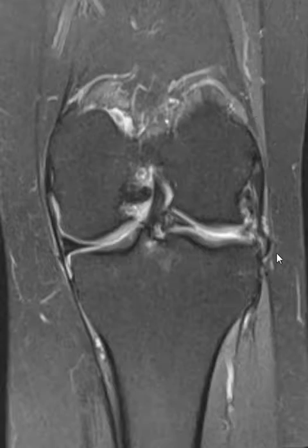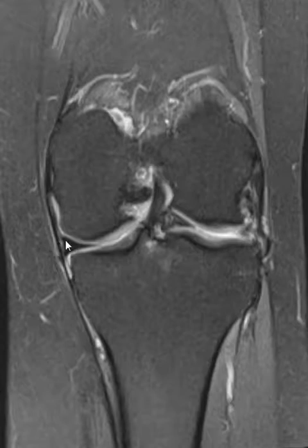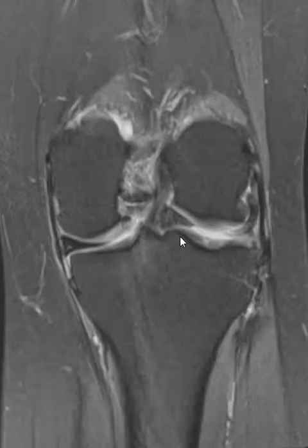And so to start off on the lateral side, here's a lateral meniscus. On this midline coronal sequence, you see the medial meniscus looks great, nice triangular. It's not pseudo-extruded, not pushed outward, so hey, that looks pretty good. On this side, though, the meniscus is very small and irregular, and we see over here this big glob in the central part of the knee joint hanging over the tibial spine. So this is a large bucket handle fragment.